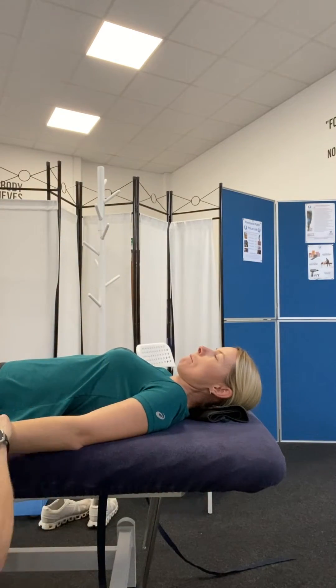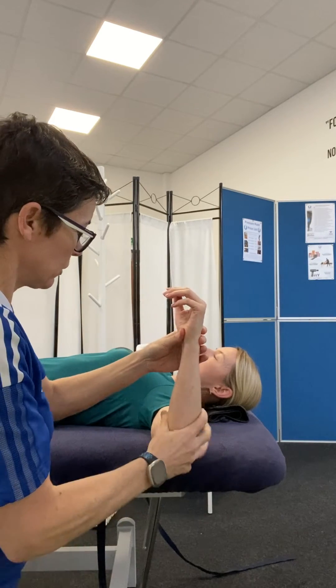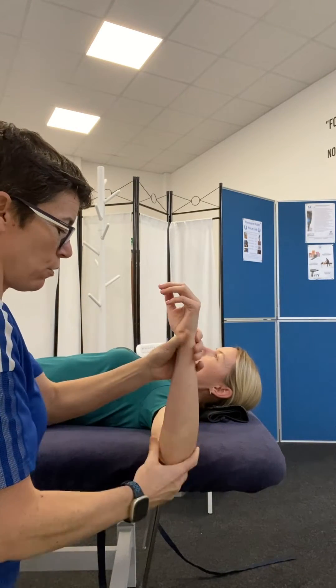I'm going to be measuring medial and lateral rotation of the shoulder joint with the goniometer. The first thing we're going to do is make sure that the client gets into the starting position, which I call neutral. I need 90 degrees at the shoulder and 90 degrees at the elbow.